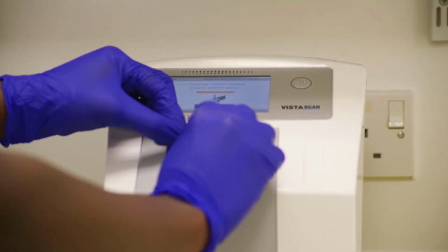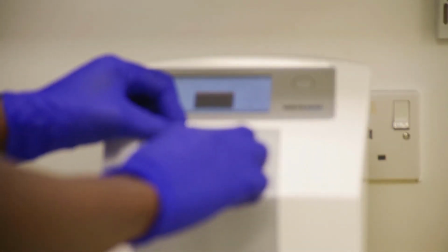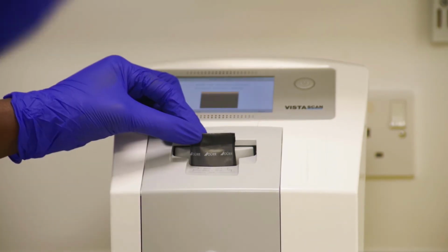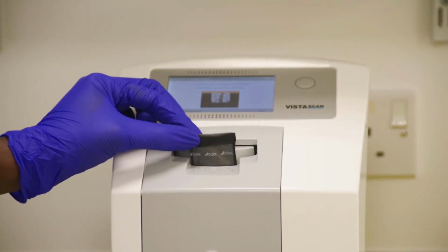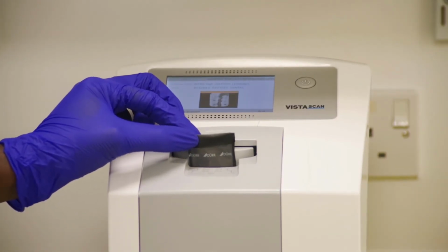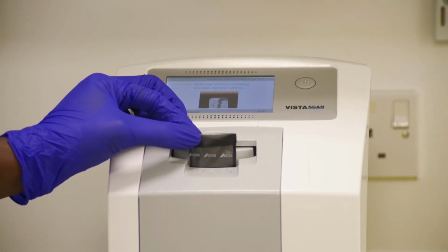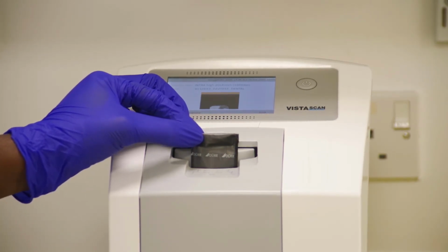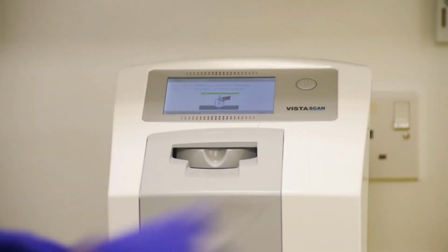and then what you do is gently push the phosphor plate down the processing equipment, holding on to that packet. Okay, you don't want to feed it with the packet because it won't scan the image if you've got the rubber going in with it. So hold on to the packet and gently push your phosphor plate in. It will read the image and then wipe the phosphor plate and come out clean at this tray here. Okay, once it's ready, it would open up and then I can take this and drop that in the clinical waste, okay?